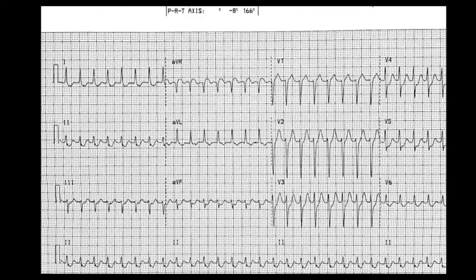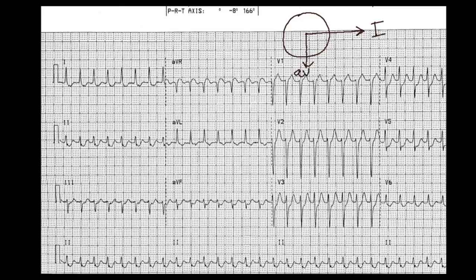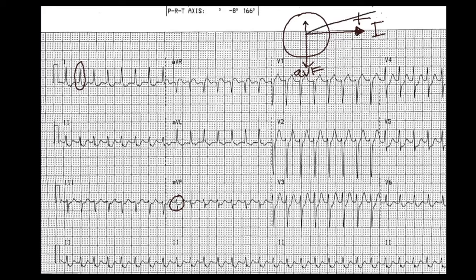Next is axis. Drawing a circle, the line going out this way is lead I, and the line going down is AVF. Lead I shows very positive QRS complexes, so we're heading in the leftward direction. AVF shows a slightly negative QRS complex, so we're going in the opposite direction — slightly superior. The computer measures this out at negative eight degrees.